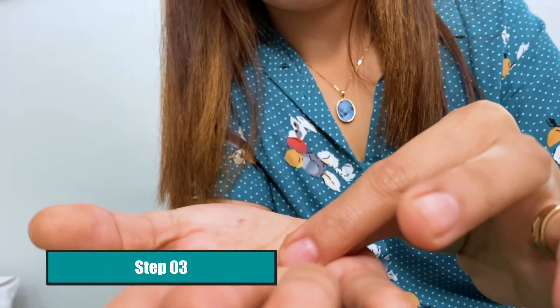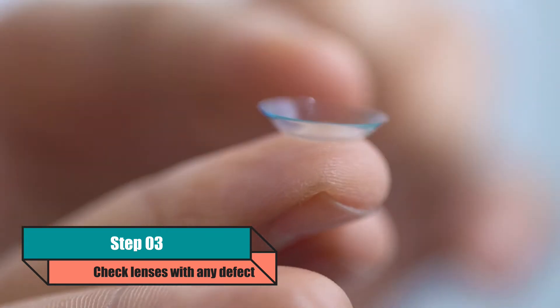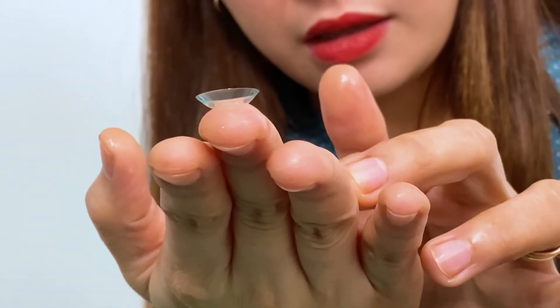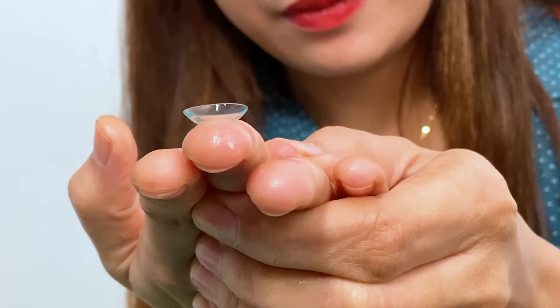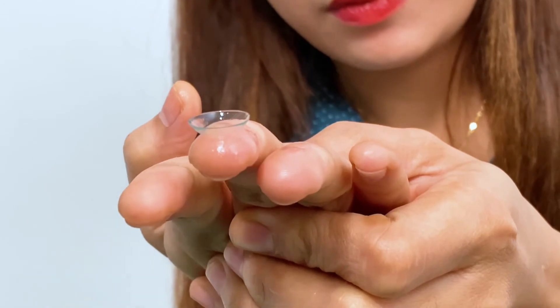Third, inspect your contact lenses for any defects or foreign bodies that may be present. Check which side is the correct side and check the shape of the lens from the side. If you have difficulty seeing these, use your glasses first. It should be in a perfect bowl shape, facing upward and not turned outside.